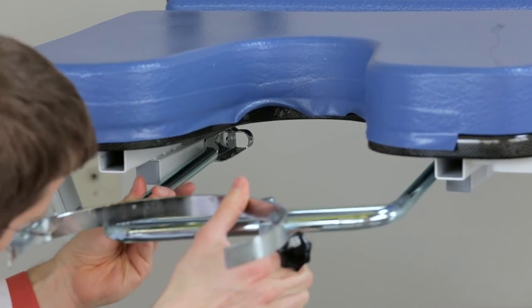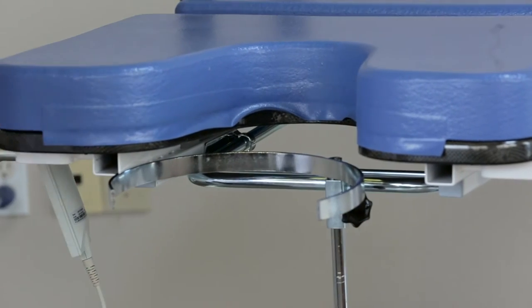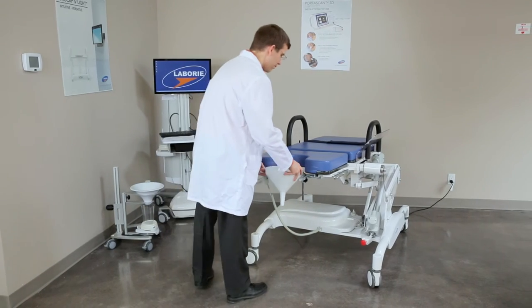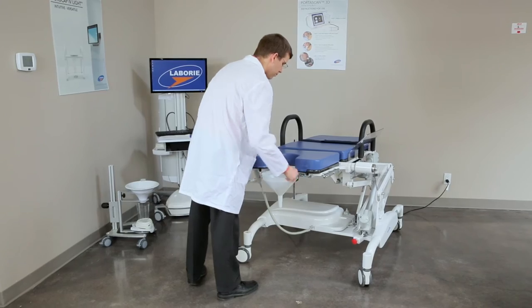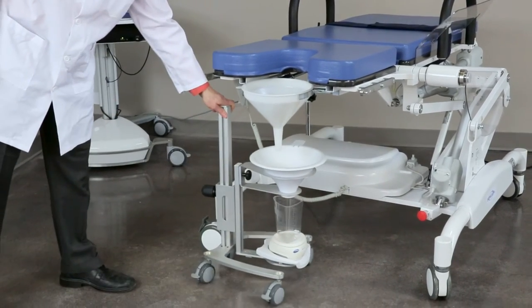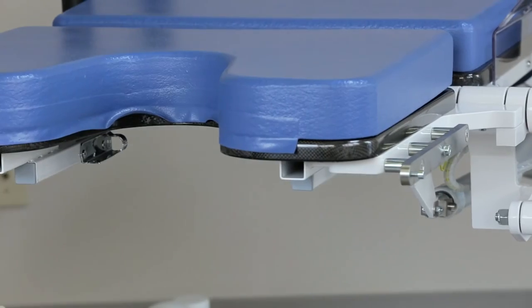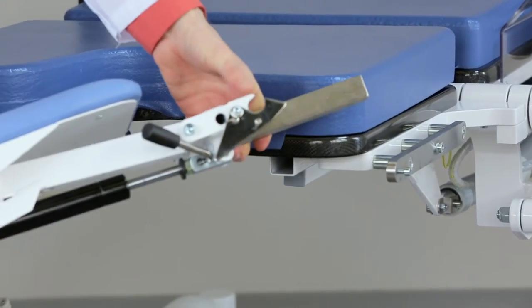Insert the plastic drainage funnel holder at the end of the table underneath the seat, line up the bracket, and slide it into place. Insert the plastic funnel into the holder. The flow meter will then sit underneath the funnel.